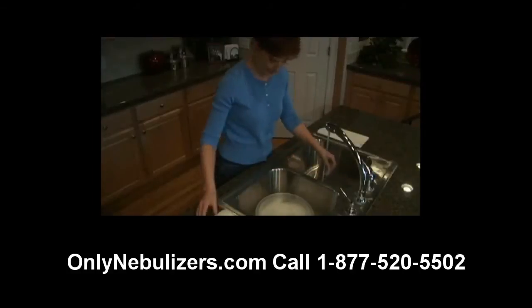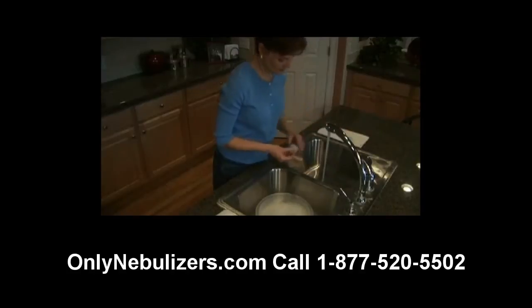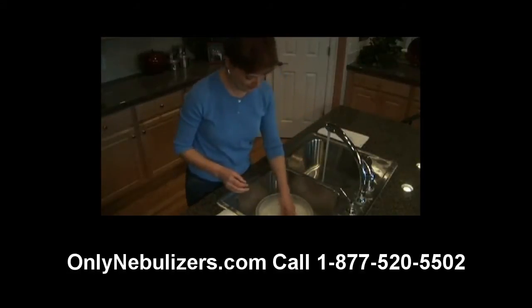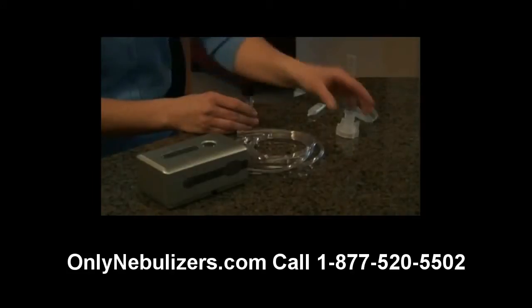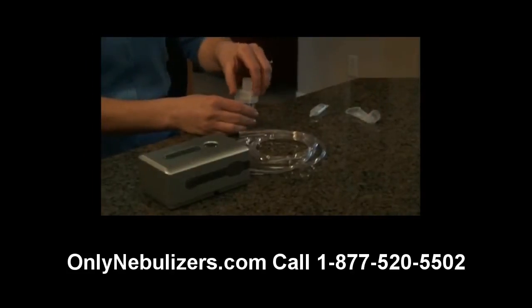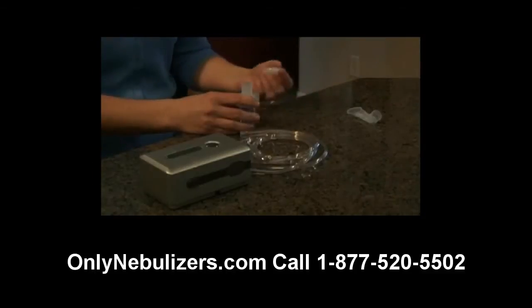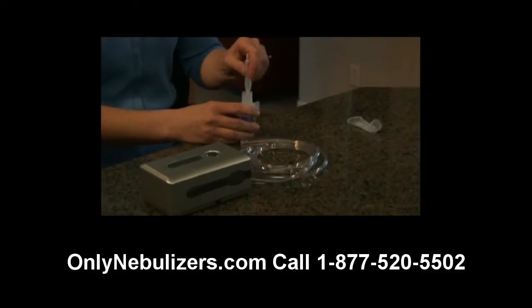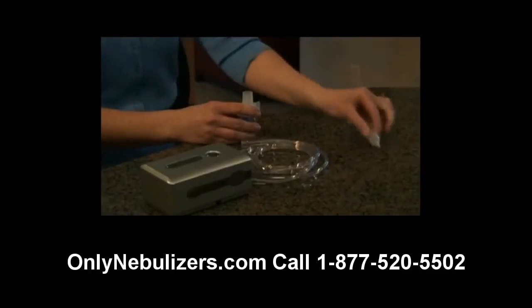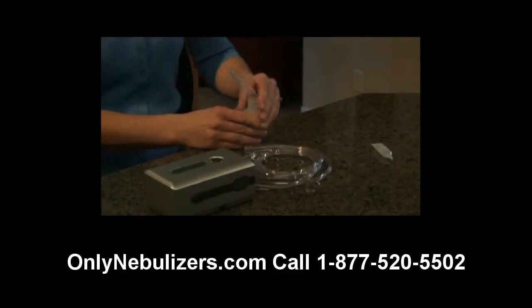Before you use your nebulizer for the first time, clean all parts by following the instructions provided later in this video. After washing your hands, insert the baffle into the nebulizer medication cup. While holding the cup, attach the nebulizer cap by turning clockwise. Next, add the prescribed dosage of medication into the nebulizer through the large opening in the top of the nebulizer cap and attach the mouthpiece to the cap by pushing gently straight down.